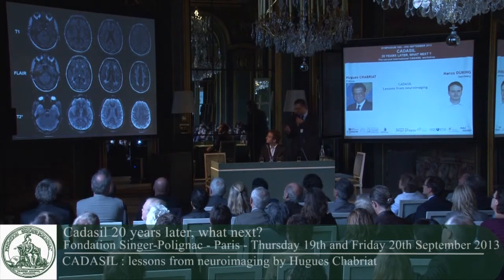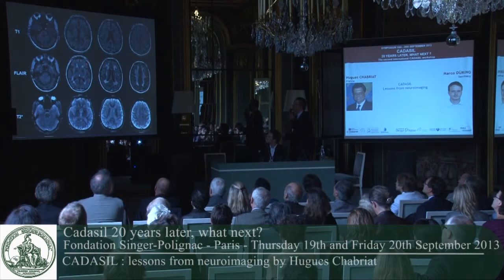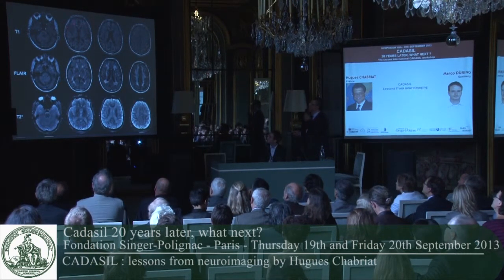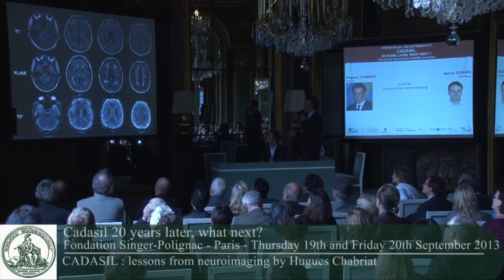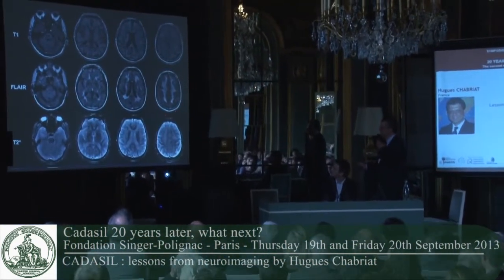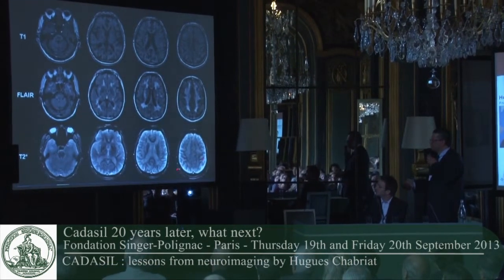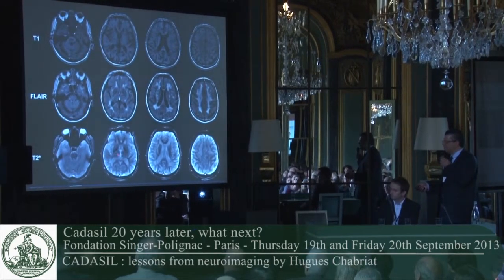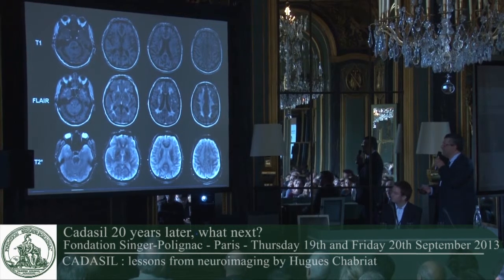Yes. You can see here the typical presentation of CADASIL patients. Here, T1 weighted images and these small lacunar infarctions. Here, T2 or FLAIR images with the diffuse and widespread white matter lesions. And in a significant proportion of patients, we can detect in CADASIL hypointense lesions typical of what we call microbleeds.